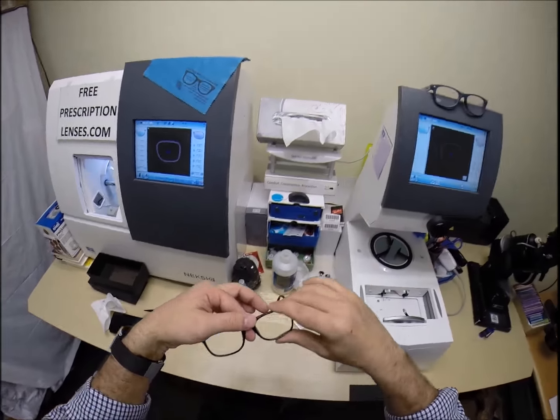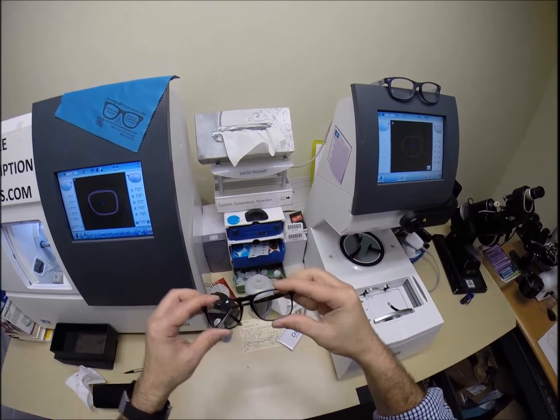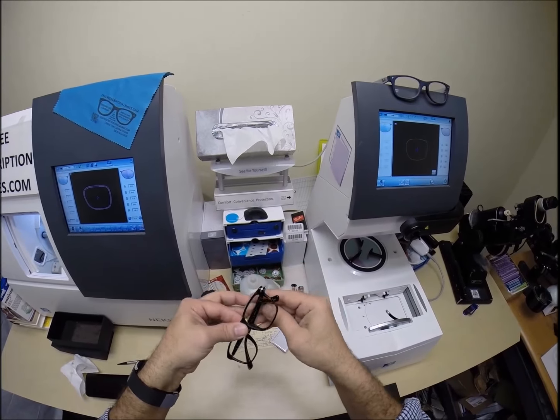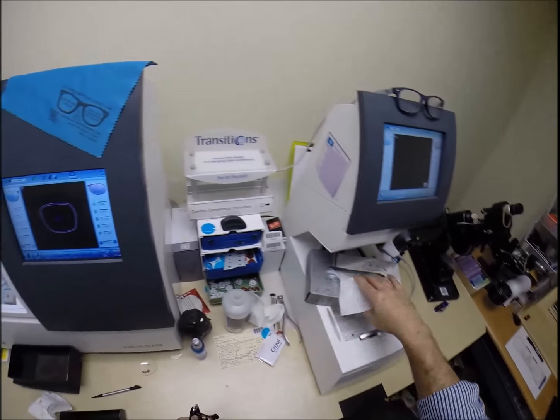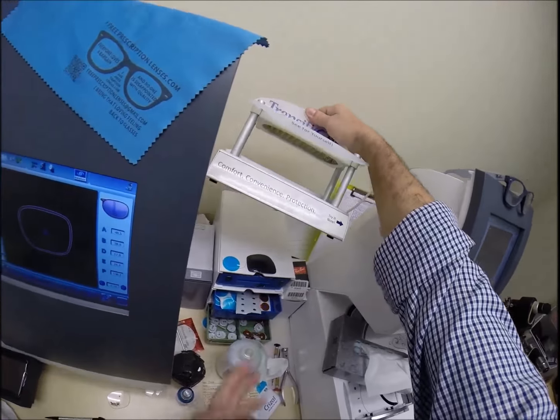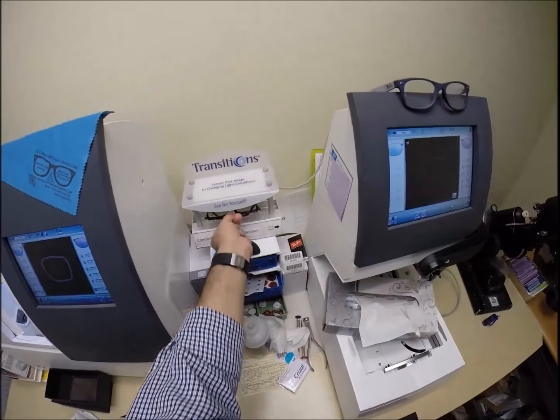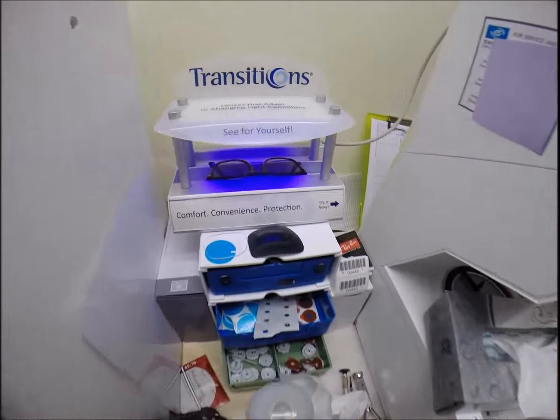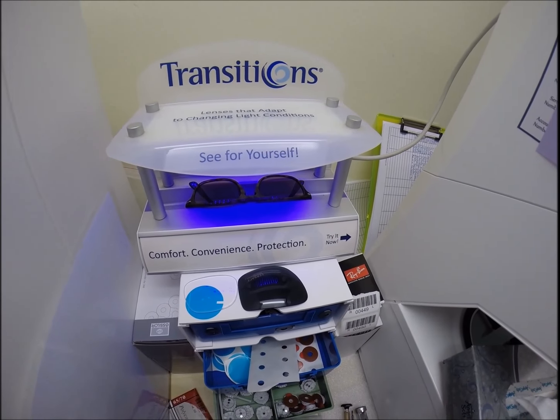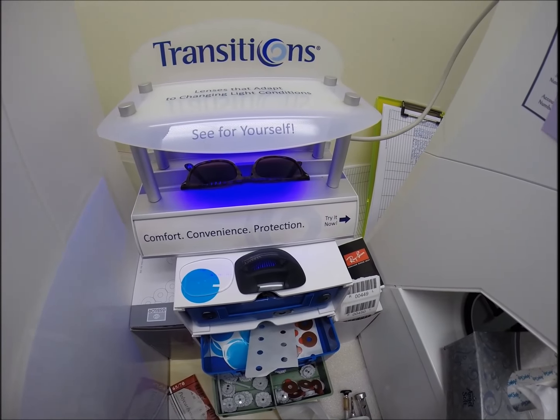The great thing is if you're left-eye dominant you could buy a pair of plus 2 over-the-counter reading glasses for extended reading. But because you have four steps of astigmatism correction in the right eye, it just may not make it as crisp as you need it, and you still may suffer eye fatigue if you try to read with over-the-counter reading glasses for more than 30 minutes to an hour.